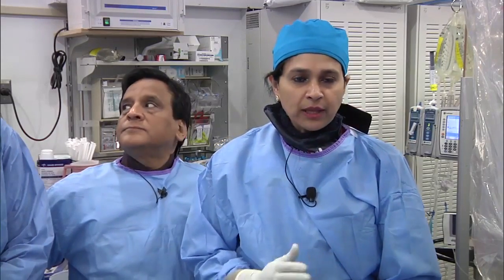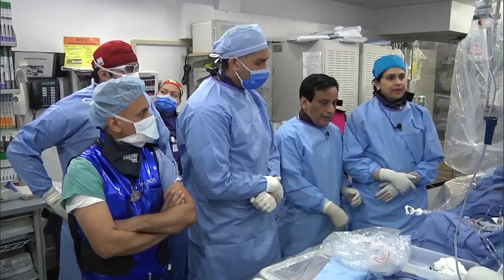So I could just tell you how you go through the CTO wire escalation. It is very simple. Have your three wires, and you decide which wire you are going to work with. Keep them with you, and just familiarize yourself with these wires, and keep doing the same thing in every case, and you'll be able to succeed. All right. Thank you.